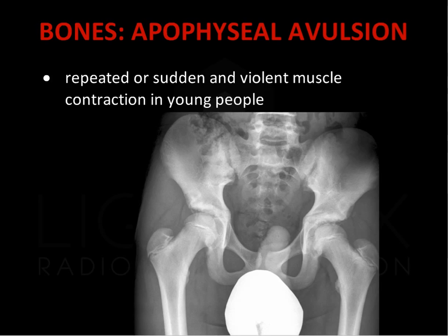In adolescence, strong muscle contraction can result in avulsion of the apophysis from which the muscles insert. This most commonly occurs at the ischial tuberosity associated with hamstring tendon insertion, and the anterior inferior iliac spine associated with the rectus femoris muscle. In this case, there is apophyseal avulsion from the left anterior inferior iliac spine.